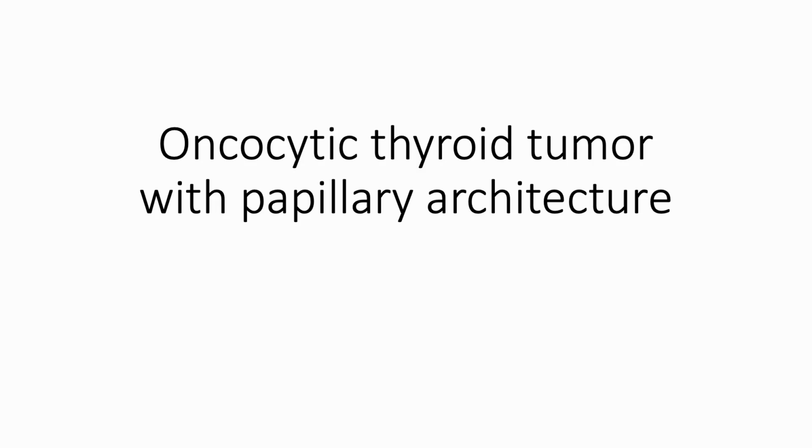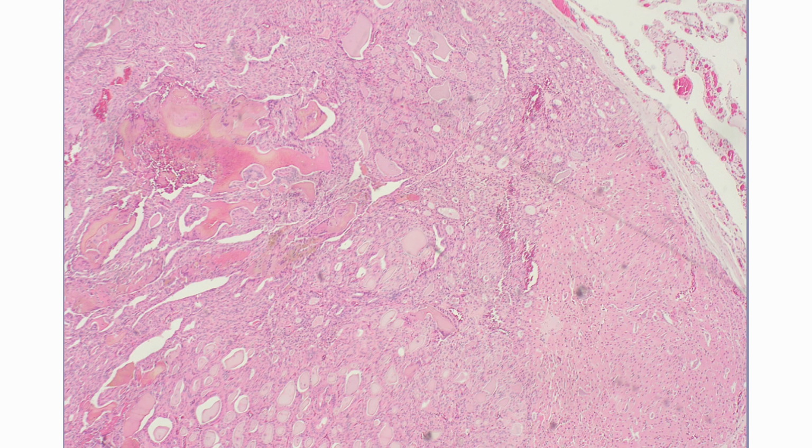Today, let's discuss oncocytic thyroid tumors with papillary architecture, a topic that remains challenging and controversial. Pathologists frequently disagree on the diagnosis. However, accumulating evidence has helped build consensus regarding the nature of this uncommon entity. In this first image, we see a well-circumscribed, encapsulated thyroid tumor.